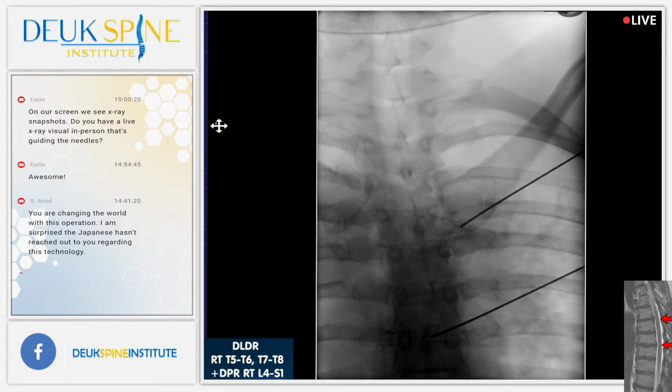See that? There's some kind of a growth there. Yeah, the whole thing. It's something very unusual. Let's go back, yeah. But you don't see it at the other levels, it's just there. Let's go down, back to a lateral view.